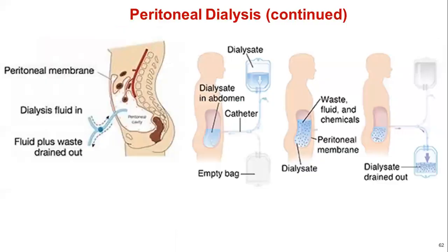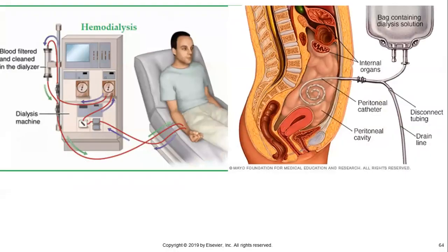So peritoneal dialysis, I can show you a picture like this one. This is the peritoneum layer, right? So we can put the catheter, and the good water goes inside the peritoneum, and the waste product comes, and then the waste product goes down to the outside in the bag. So peritoneal dialysis, we do it in the peritoneum, right? This is an alternative to hemodialysis.